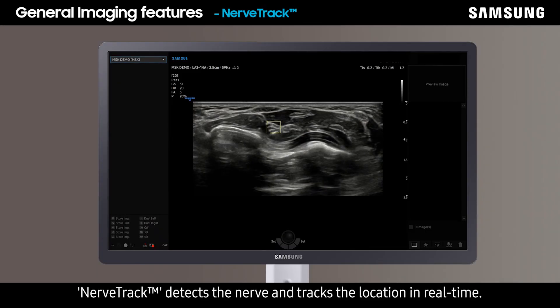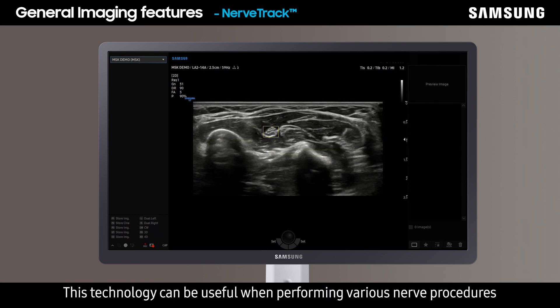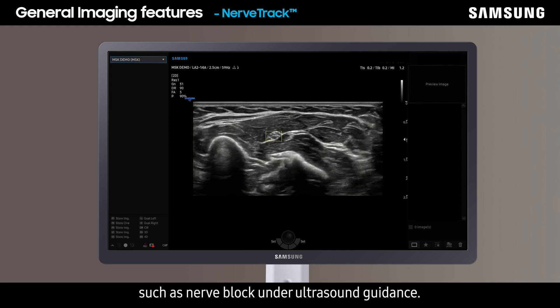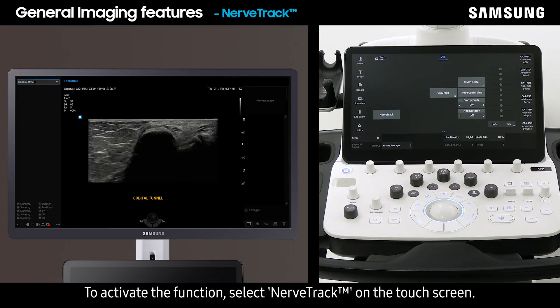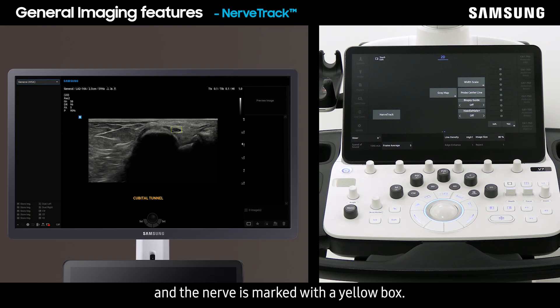NerveTrack detects the nerve and tracks its location in real-time. This technology can be useful when performing various nerve procedures such as nerve block under ultrasound guidance. To activate the function, select NerveTrack on the touch screen. The system automatically detects and traces the nerve, and the nerve is marked with a yellow box.